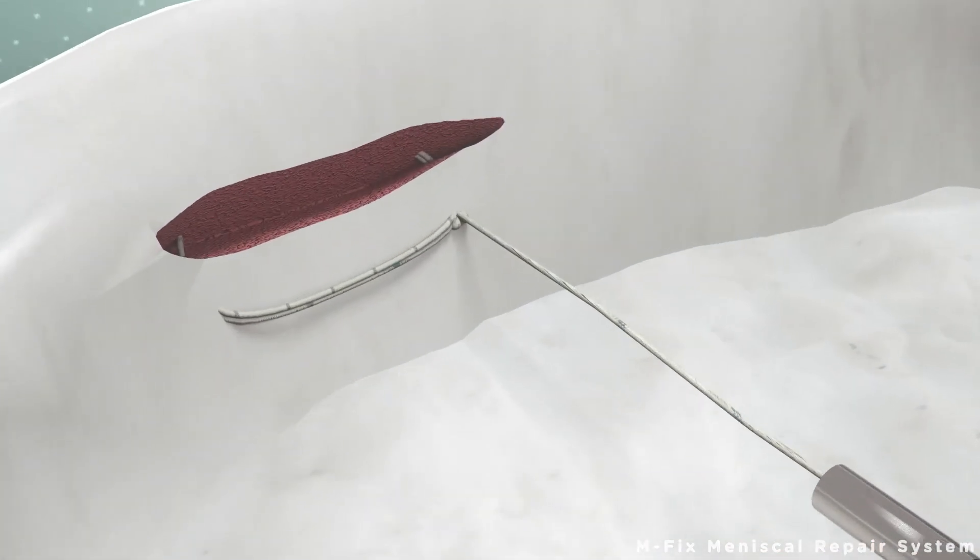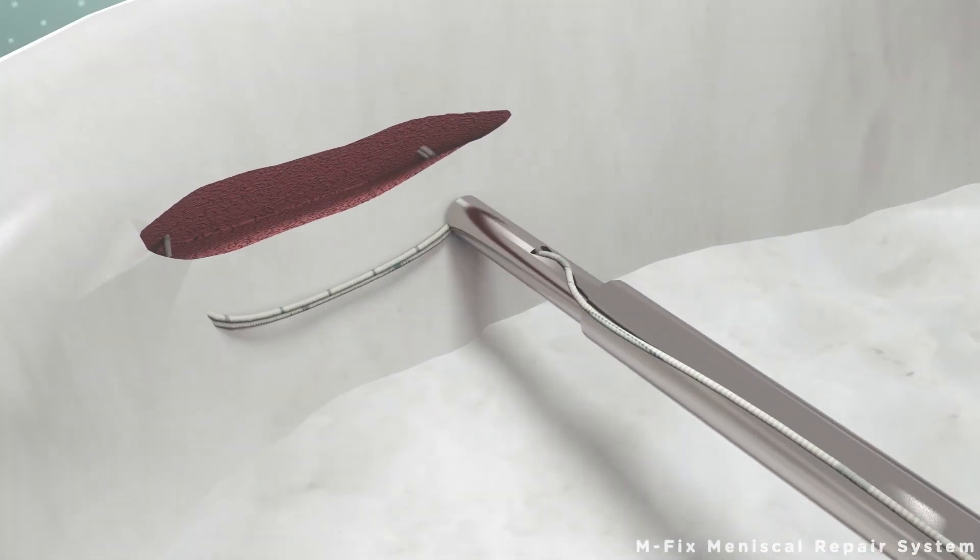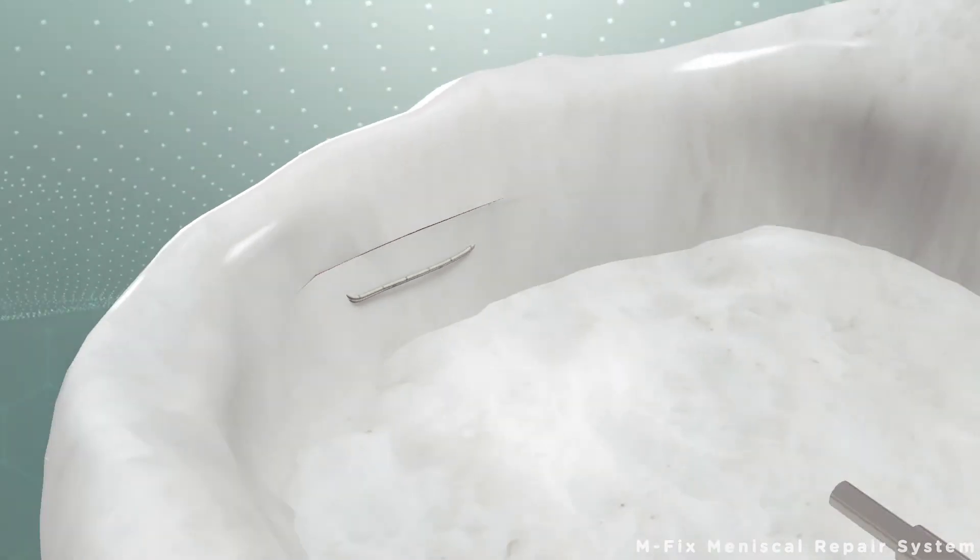Lastly, with the help of the button trigger and the suture cutter, the knot is cut and the operation is finished.